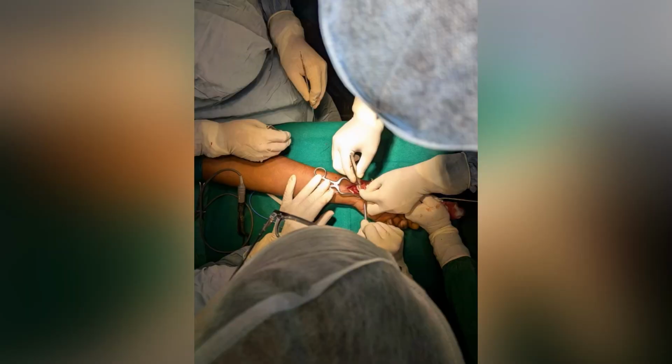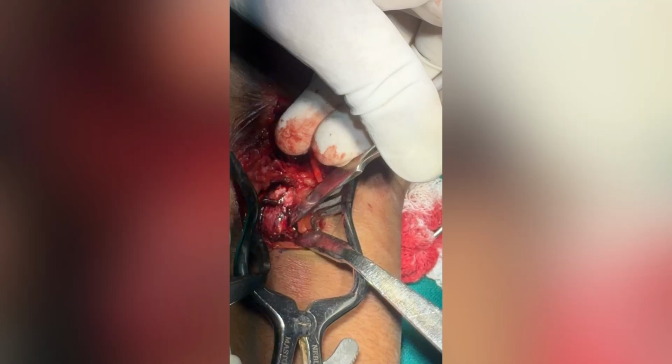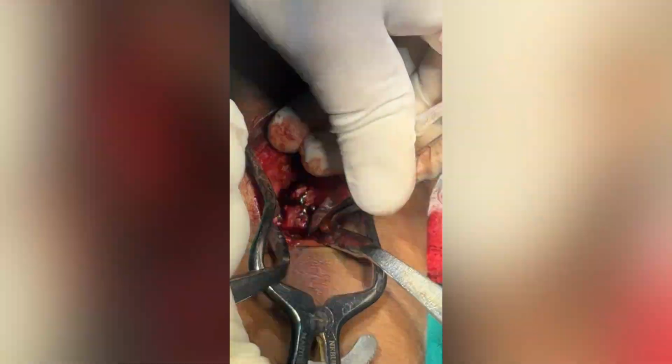So the structures at risk when we are operating through the volar approach are the radial artery, the palmar cutaneous branch of the median nerve, and the FCR tendon, which we can properly retract.